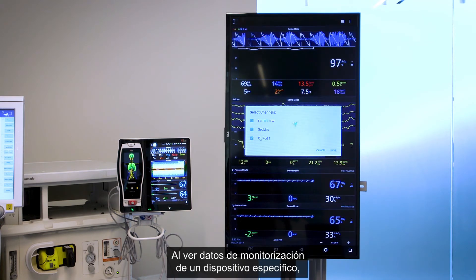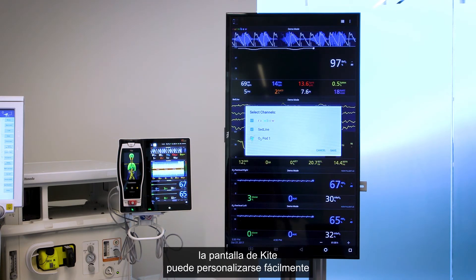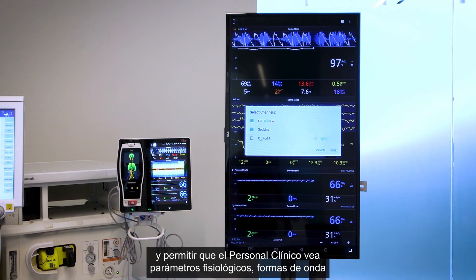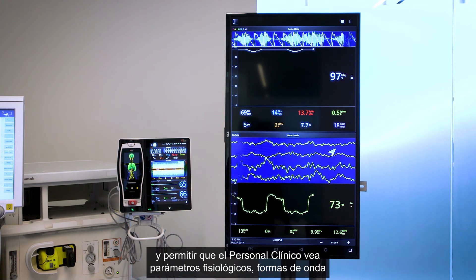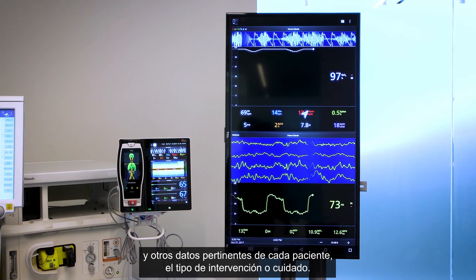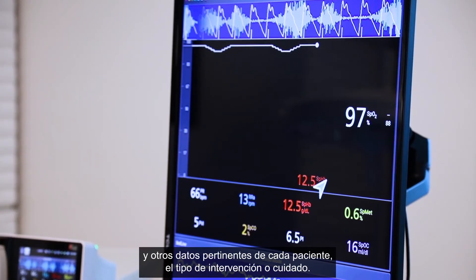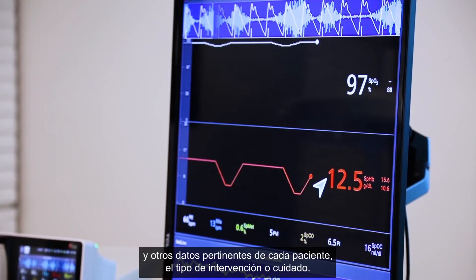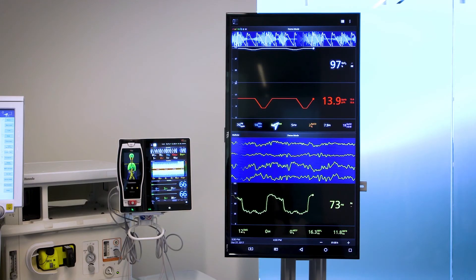When viewing a particular device's monitoring data, the Kite display can be easily customized, enabling clinicians to view the physiological parameters, waveforms, and other data most pertinent for each patient and type of care or operation.